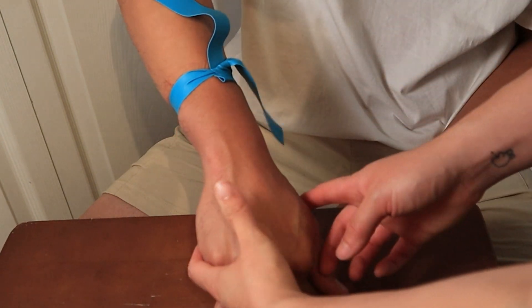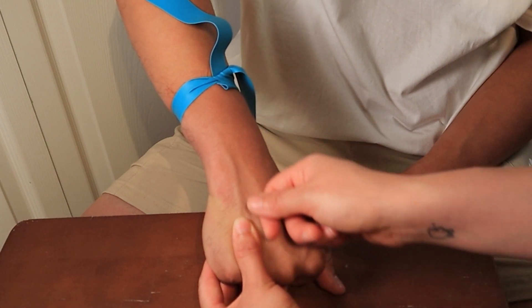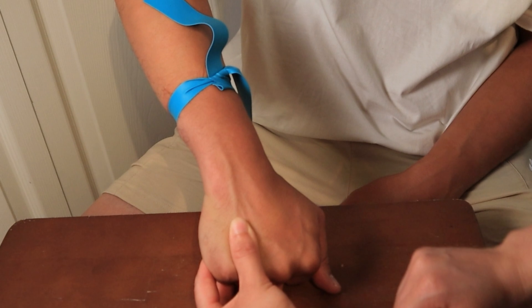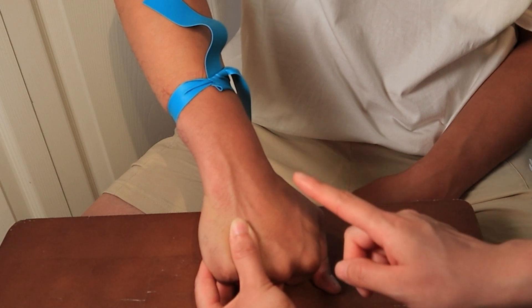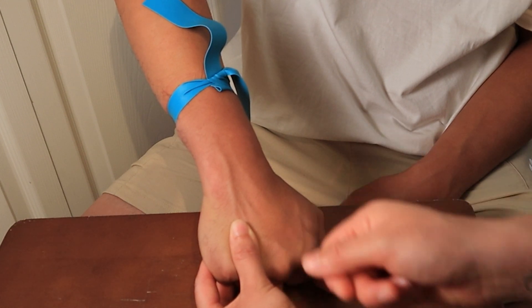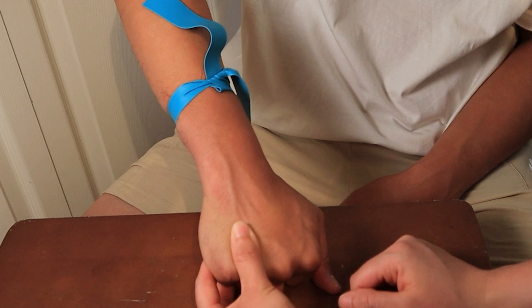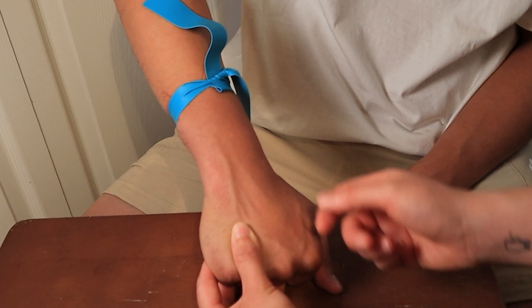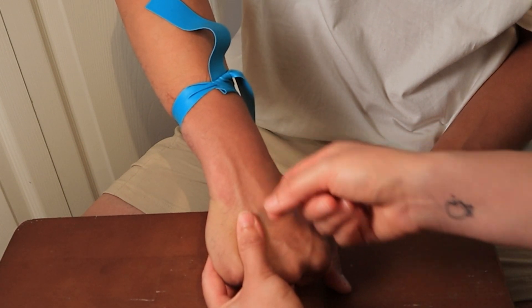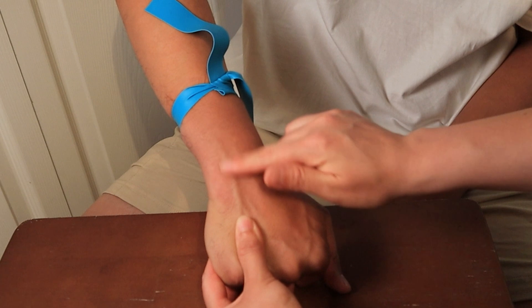One last tip: when you're ready to go into the vein and you know your angle and direction, don't go in too fast or too slow. Going in too fast means you can lose control and hurt the patient. Going in too slow can also be really painful. Just use a nice, quick, controlled speed and the patient should barely even feel it.